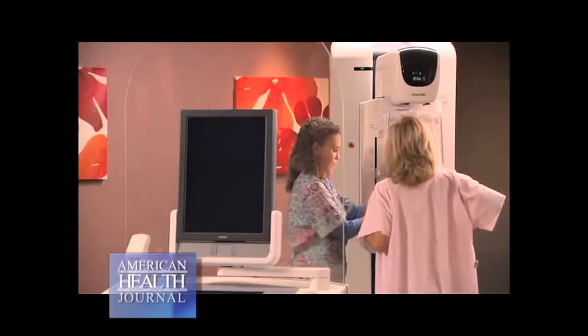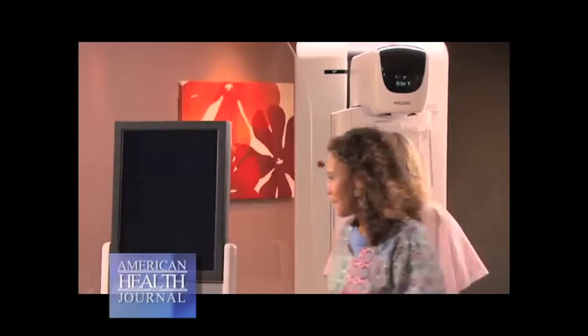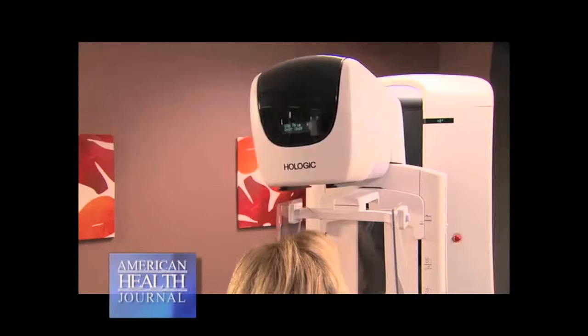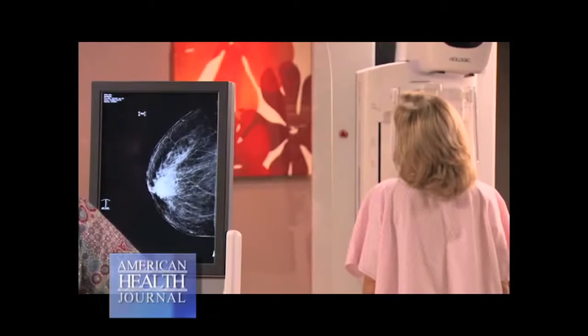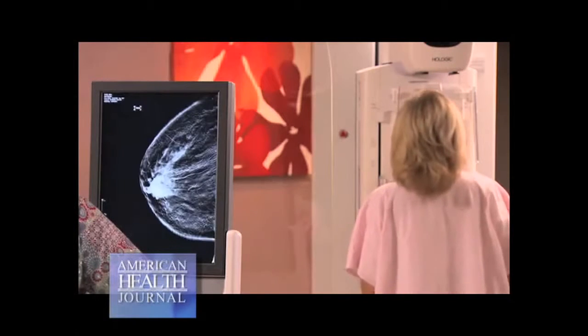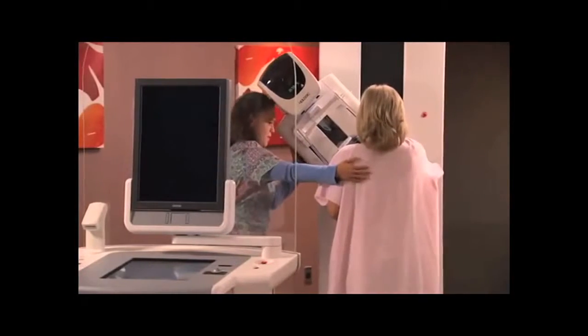It seems that digital breast tomosynthesis will improve the detection of breast cancer by about 7, 10, perhaps 15%. That is, it increases our cancer detection rate by about that much. And so we do expect that we'll find a few more breast cancers, 7, 10% more, than we would have found using regular digital mammography, which was the antecedent of breast tomosynthesis.